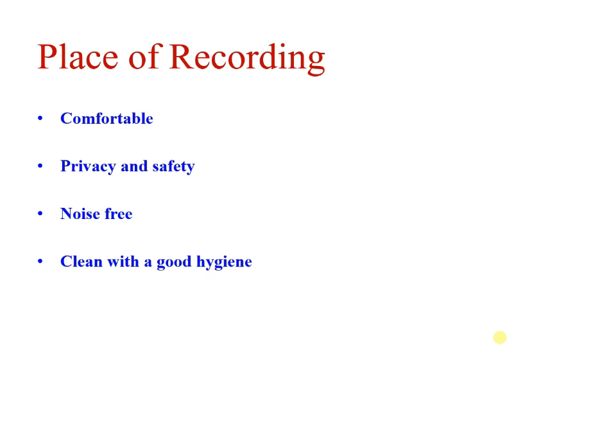The privacy and safety is important because in most cases, when you are dealing with a 12 lead ECG, the recording requires you to unclothe the upper body, because the electrodes are placed on the chest area. So to make the volunteer more comfortable, we need a room that offers much privacy.